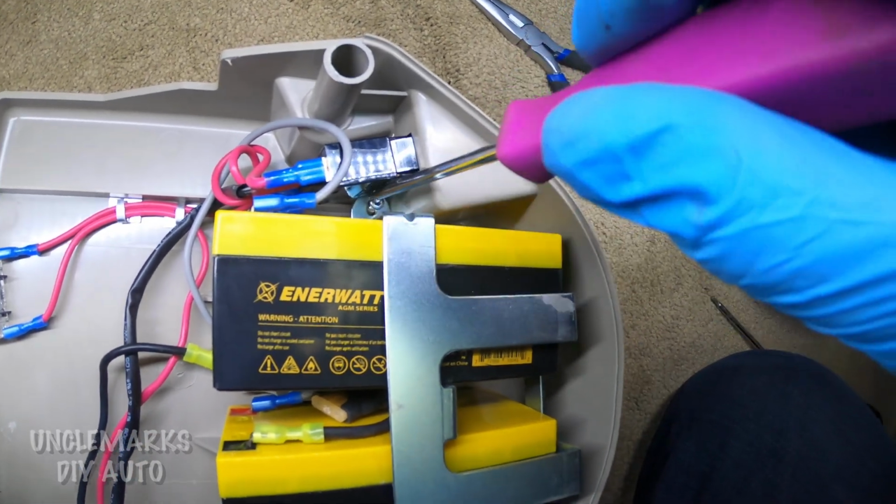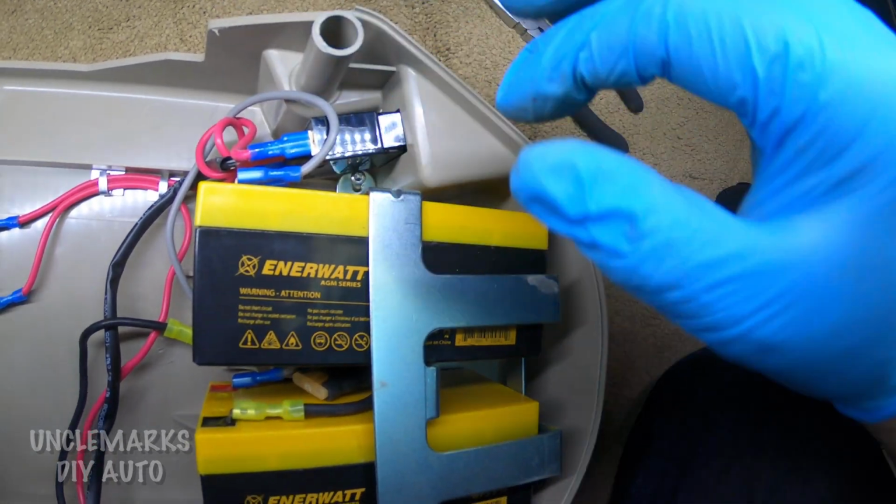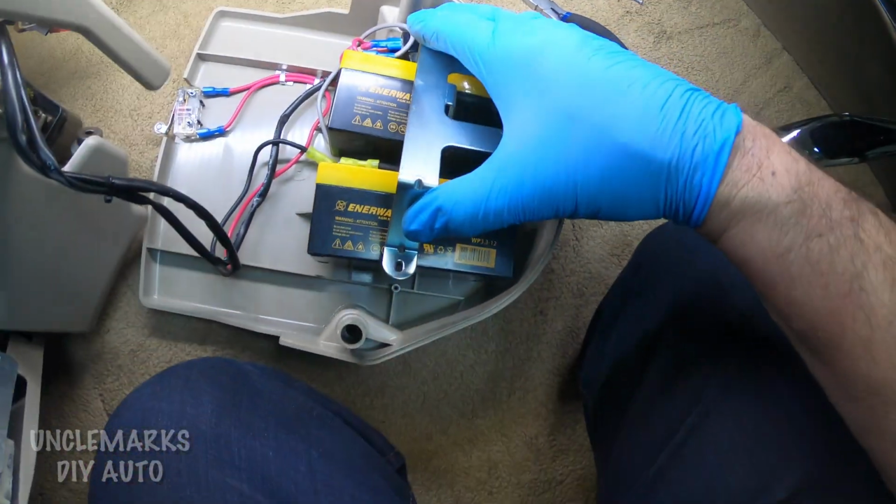Hopefully it is your battery issue here. I guess the guy could take a multimeter and check the batteries to see if they're good or not. Maybe you're having a charging problem.